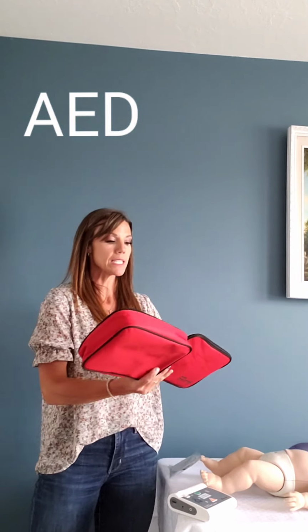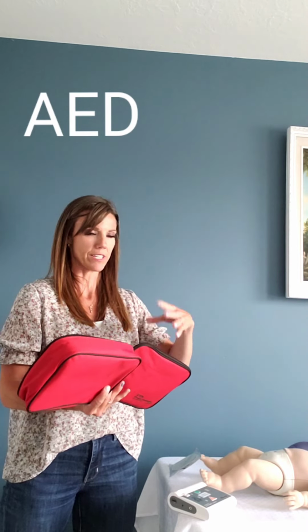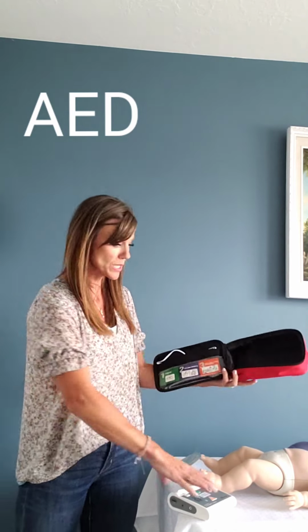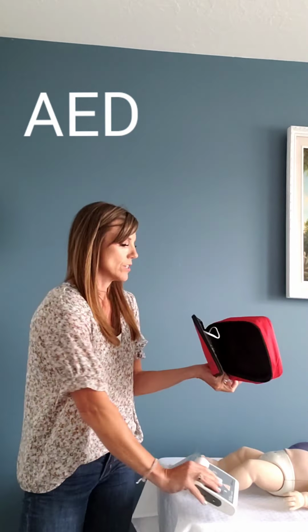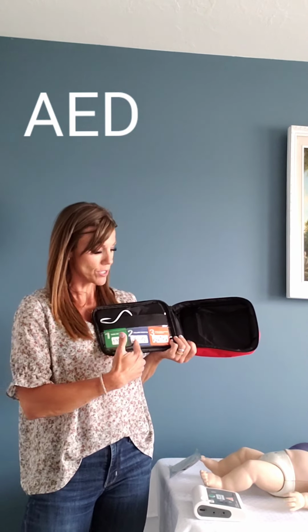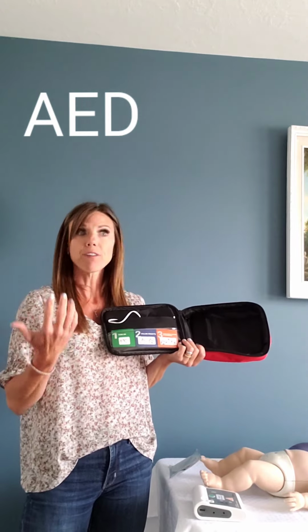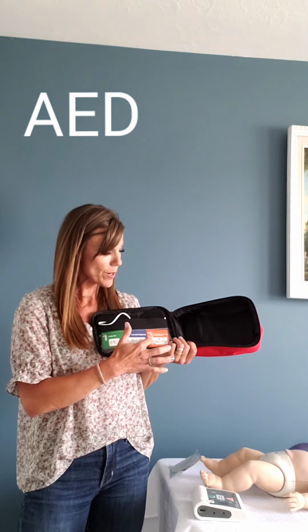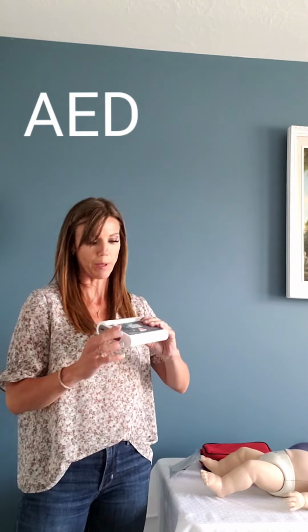Now, a couple things is people kind of get scared of AEDs and they feel like they're intimidating, but they are so simple. So I'm going to show you a couple things that all AEDs have. So first off, when you open up an AED, most of them will have instructions inside that say, 1, turn it on. Number 2, follow the promptings. Number 3, shock, and press the shock button if it tells you to press the shock button.